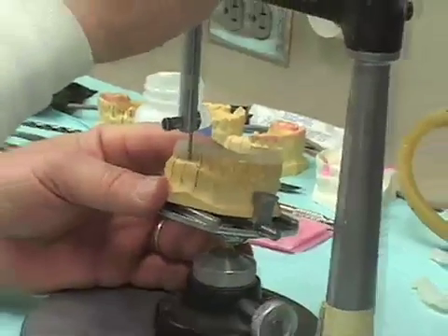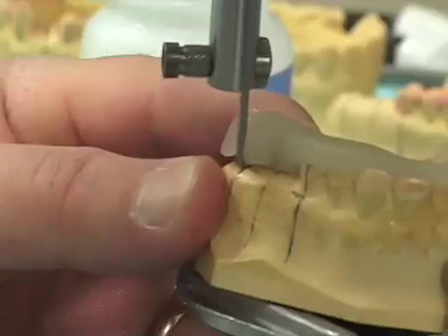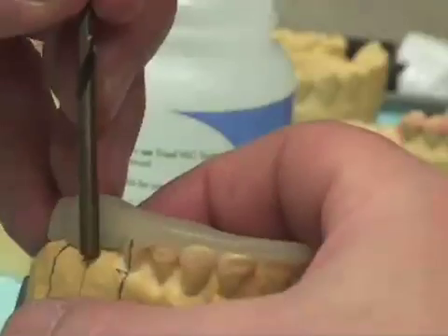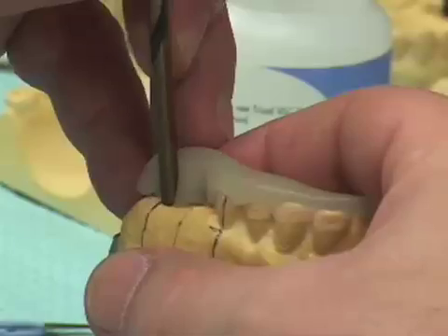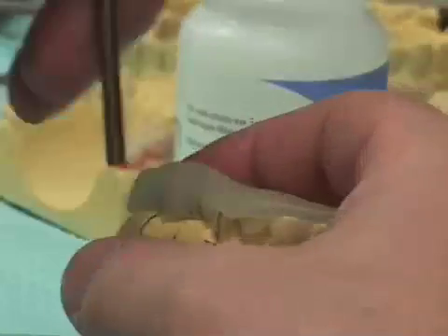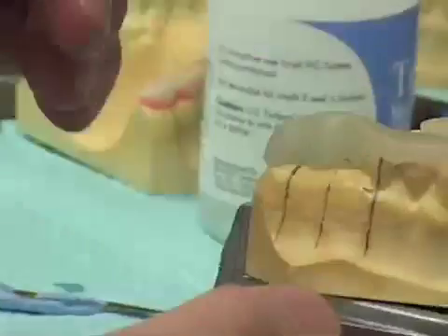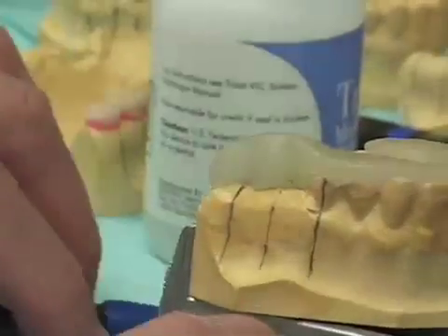I want to get an idea of where the two 2 millimeter drill blanks need to go. Another useful step is to take the 4.2 millimeter drill, brace it from the lingual, and push it in until I can see that we have exposed where we want to place our implants. This is a little taller than it needs to be right now, but you'll see how to correct that.